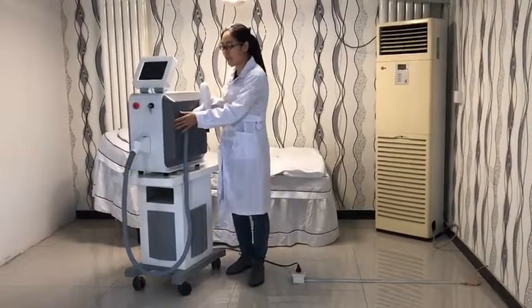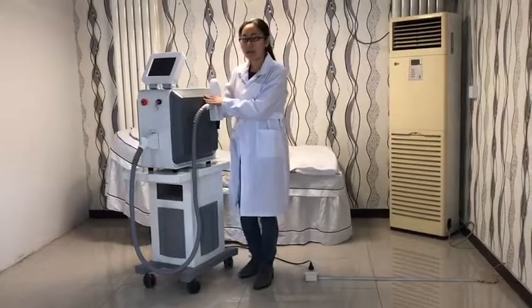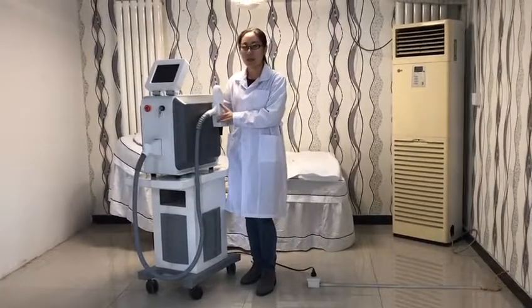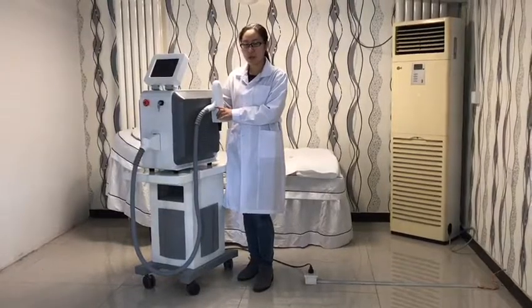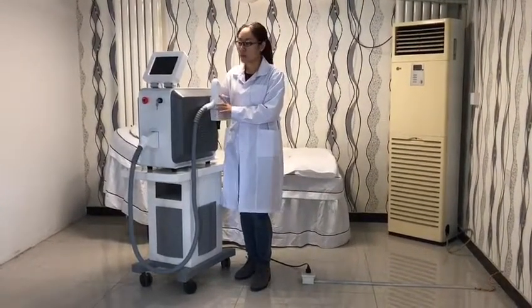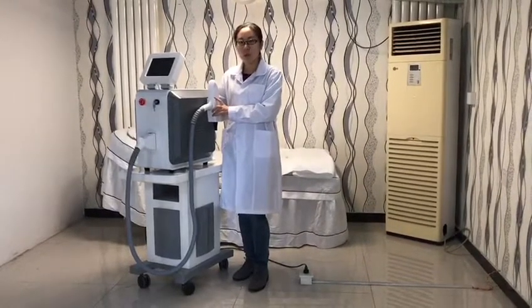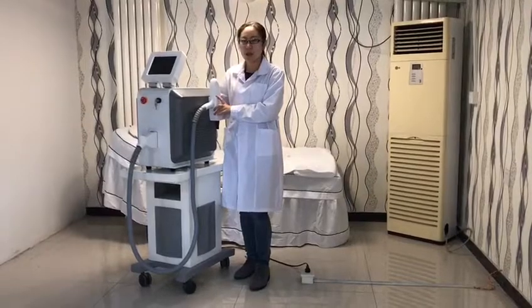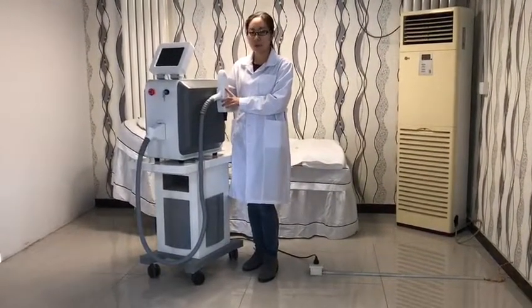The lifespan of the machine can reach one million shots. This is at least five times longer than other suppliers' machines. This is because we are the only factory who has adopted two extra water filters in this machine. The water filters can filter out water impurities and then protect our UK imported lamp very well.